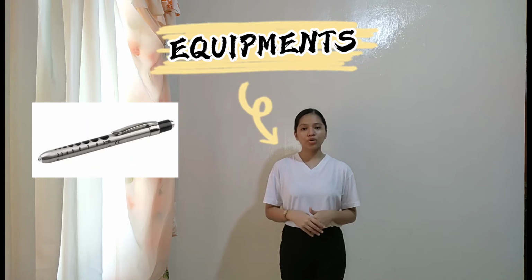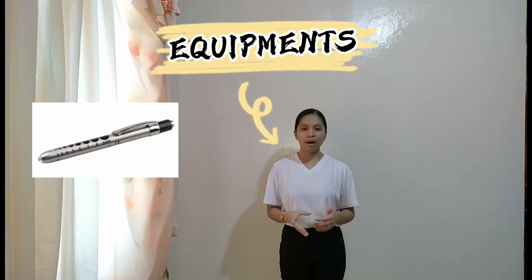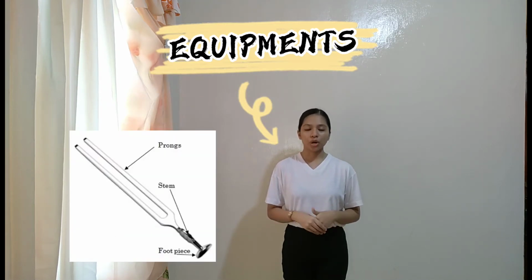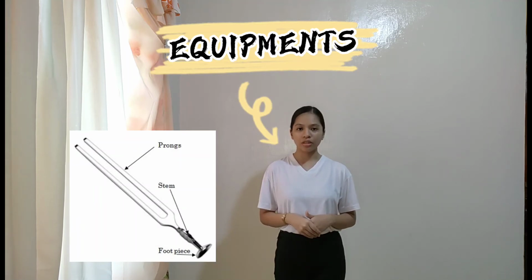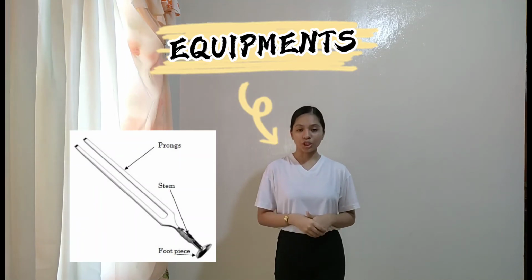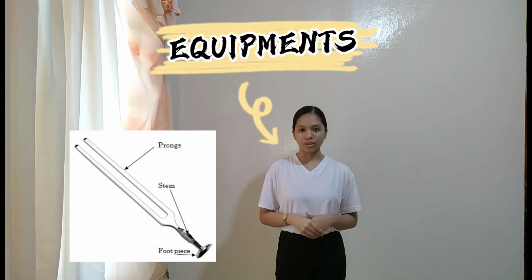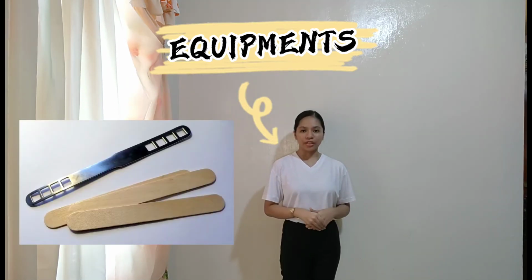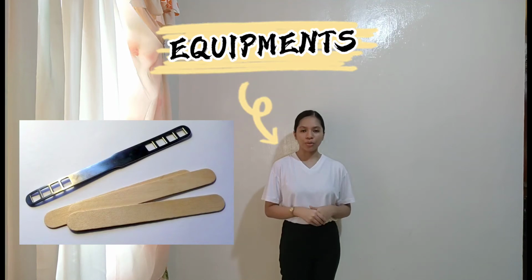It is used to visualize the eyes, pupils, ears, nose, mouth, and throat for inspection. And the tuning fork is a metal device that produces harmonic vibrations when the two prongs are struck. It is used to test hearing and bone conduction. And the tongue depressor is a tool used in medical practice that depresses the tongue to allow for examination of the mouth and throat.